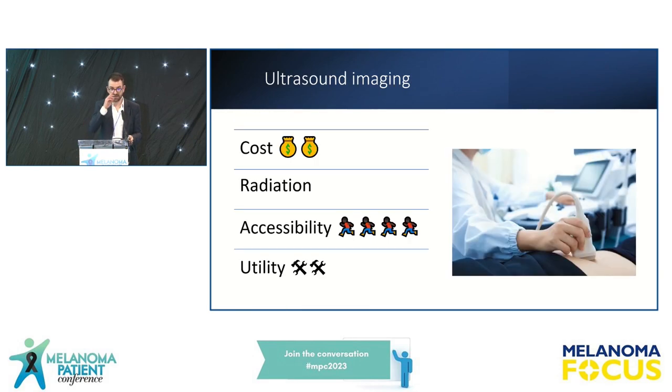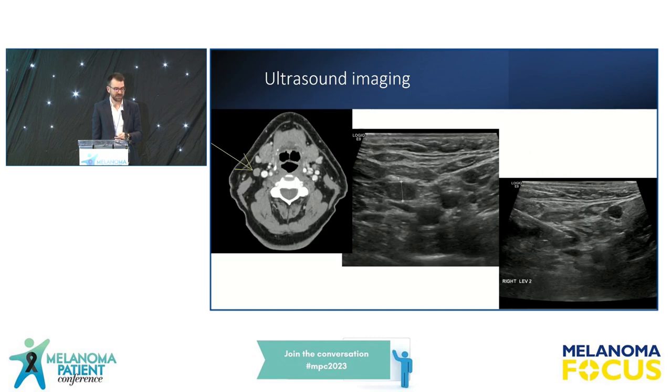Moving on to ultrasound imaging. I'm sure many of you are familiar with ultrasound for antenatal care, scanning in pregnancy, but we use it for an awful lot of other things as well. It's a little bit more expensive than x-ray. It relies on a specialist sonographer or a radiologist to do the scan, but it carries with it no radiation. It just uses sound waves, as the name suggests. Again, it's pretty accessible. A lot of GP practices now offer some ultrasound services, certainly in district hospitals as well. And in the right setting, it can be very useful.